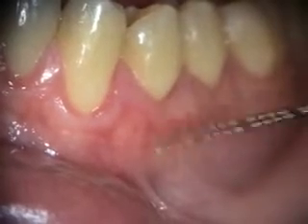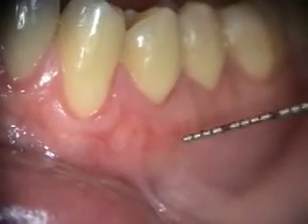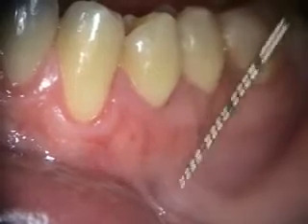This is the two-week healing of the grafting on number 21. We've got the whole root covered. You can probably appreciate some thickness here, and this is where the alloderm is underneath. I'll take a look at it in a few months.